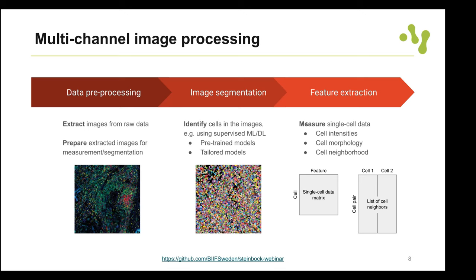The panel file gives information about what's contained in the individual channels of each image. Only certain columns are required: a unique channel identifier and the label for the channel. For example, the isotope Dy161 contains the TCF7 marker, and it's indicated whether we want to keep those channels in the extracted image.